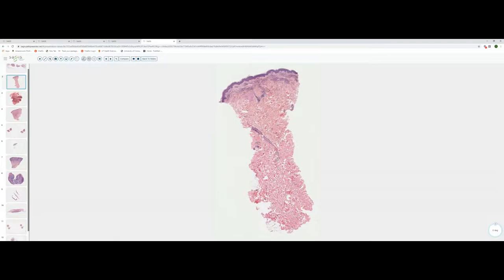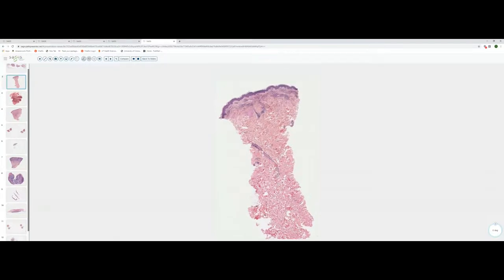Warty dyskeratomas have been reported to occur in the oral mucosa and there are no hair follicles there. So in that instance, it's the change of FAD or focal acantholytic dyskeratosis involving a salivary gland. We'll go ahead and move on to slide two. Slide two was a very skinny punch biopsy. This is from the, probably from the trunk or proximal extremity. The dermis is relatively thick.